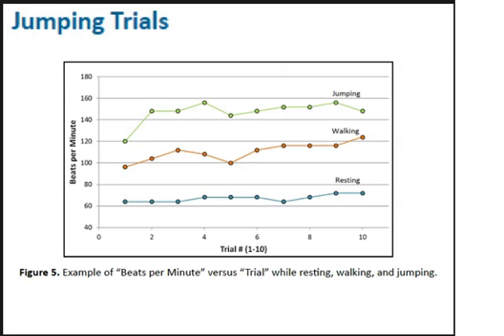Again, determine your body temperature by placing the covered thermometer under your tongue for about 1 minute. Record your temperature in data table 4. Rest while sitting for 2 minutes.